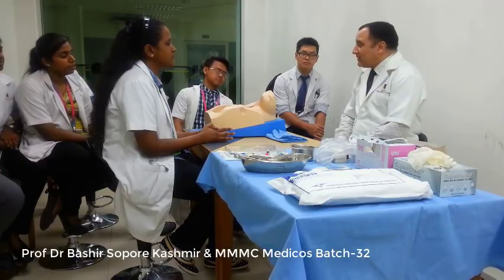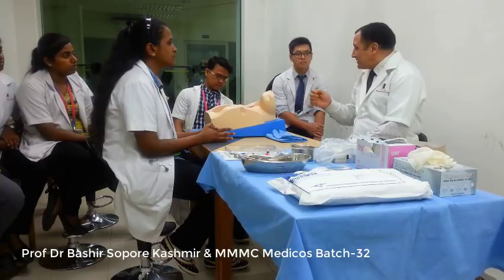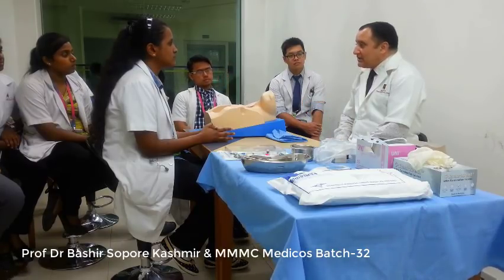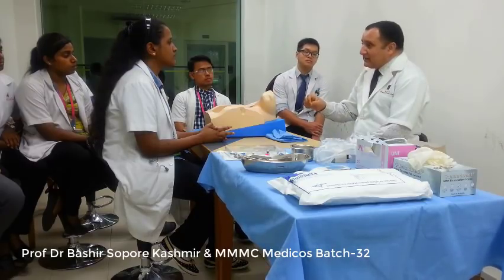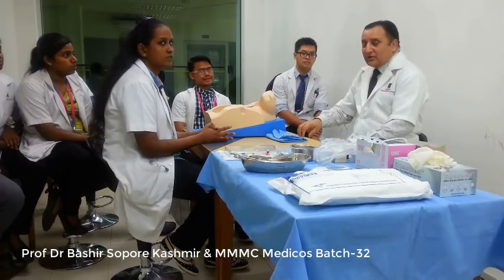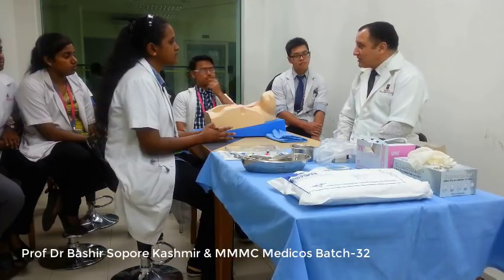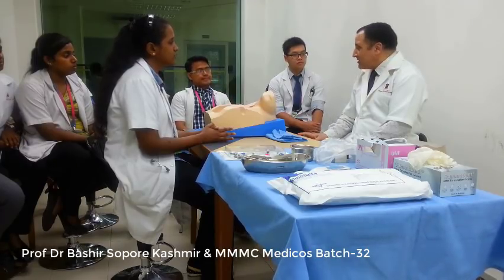So I have told you what are the indications, complications and contraindications of central venous catheterization. And once you have this background knowledge, then you will go to the patient. May I ask you what are the steps you will take to perform the central venous catheterization? Which is the first step?